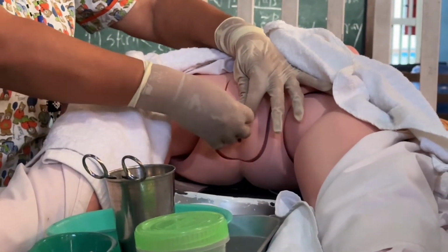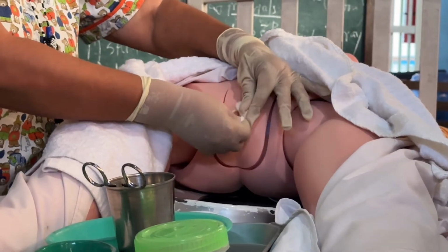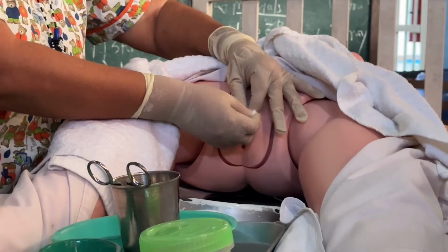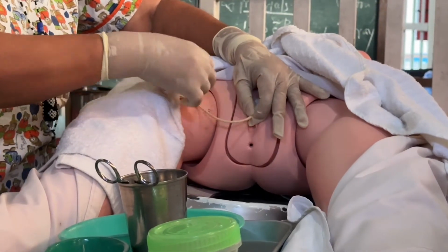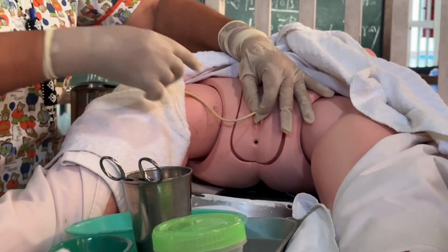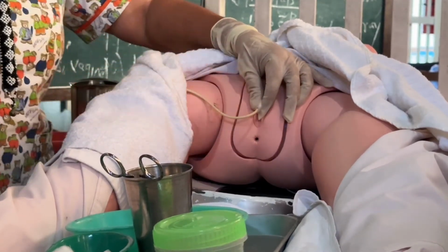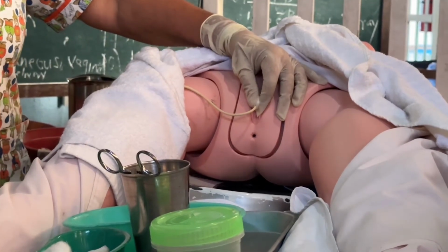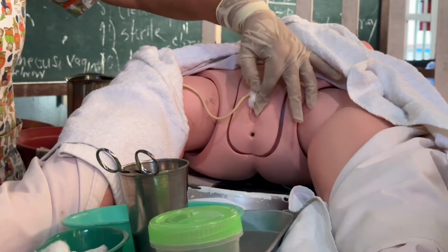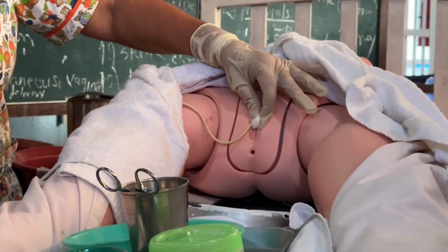Okay, hold the insertion site, clean in a rotatory motion, single stroke, at least 2/3 high, at least 3 times. Then, you're going to squeeze the cotton balls in the insertion site for the betadine to enter the urethra. Okay, then you squeeze. Do not squeeze the clitoris, ha? It's only the cotton balls that you're going to squeeze.